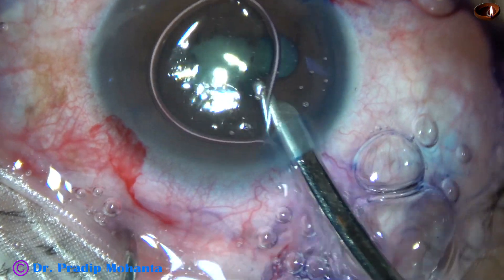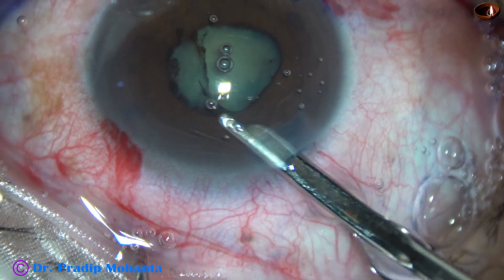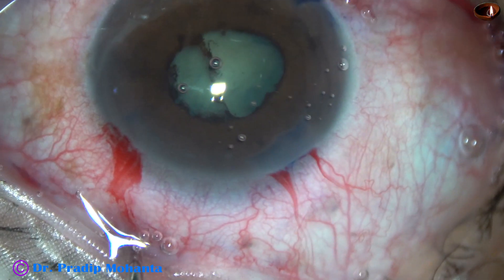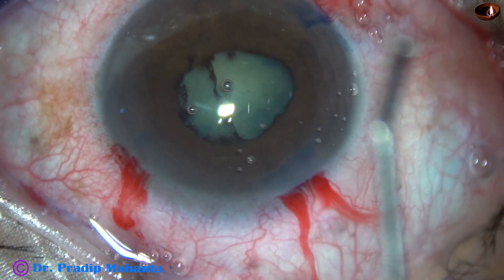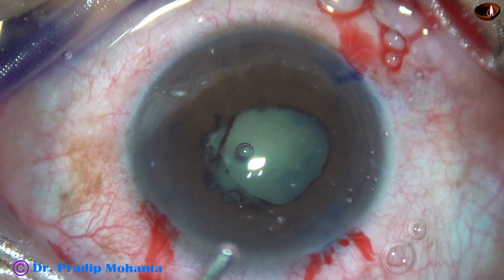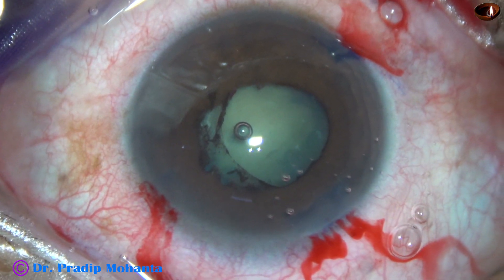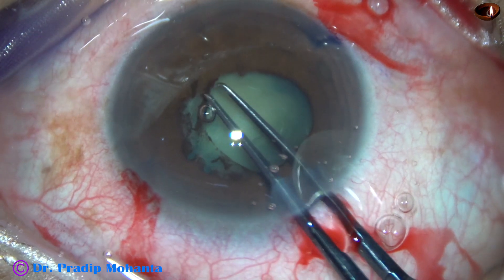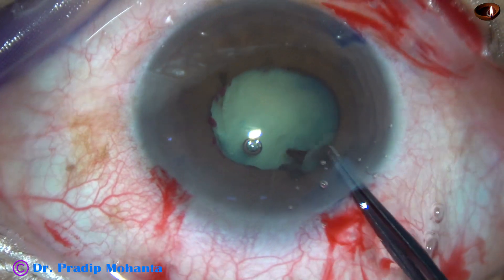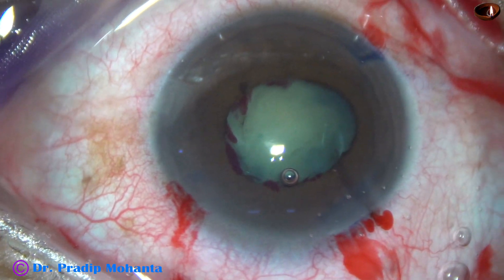And now this is a Simcoe cannula. With this, I am breaking the synechia. I can see the membrane has come to the left side. Now, 2% HPMC is injected into the anterior chamber. And I take a rhexis forceps to remove the membrane. And the membrane came off very easily. There were a few bleeding points at the pupillary margin, but the bleeding stopped by itself in a few seconds.